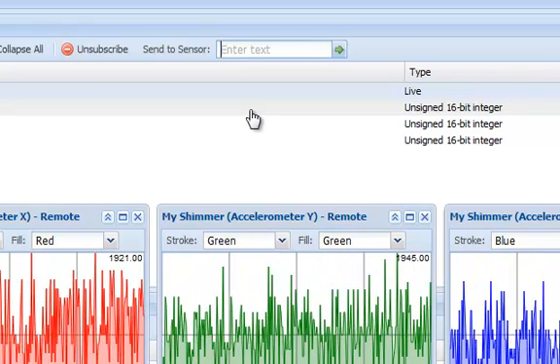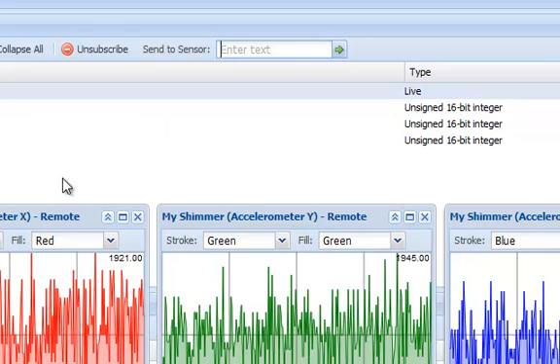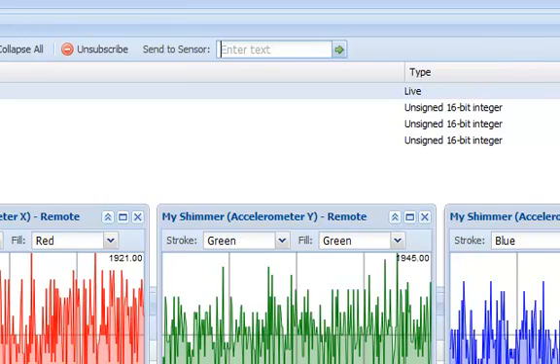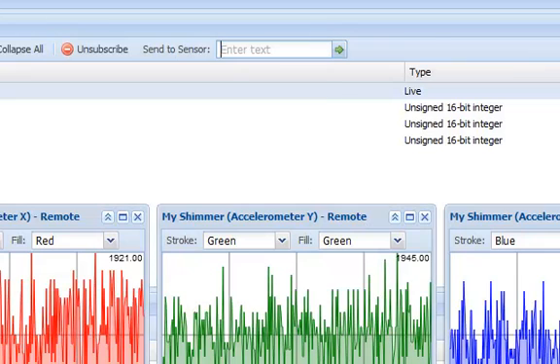As you can see, the Shimmer has stopped streaming data. I can verify that this is the case by checking Bloom. I can then turn it back on again remotely by sending another command.